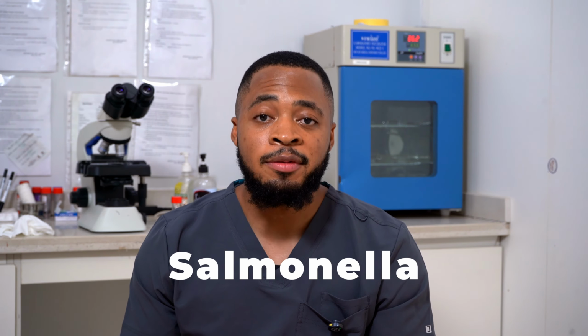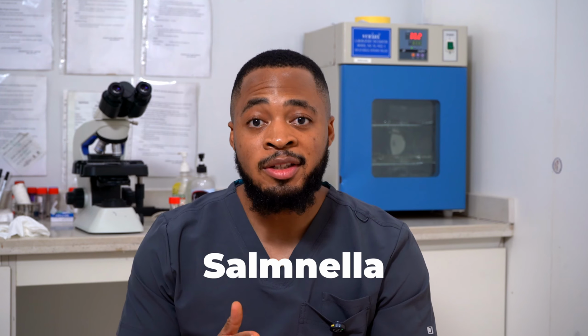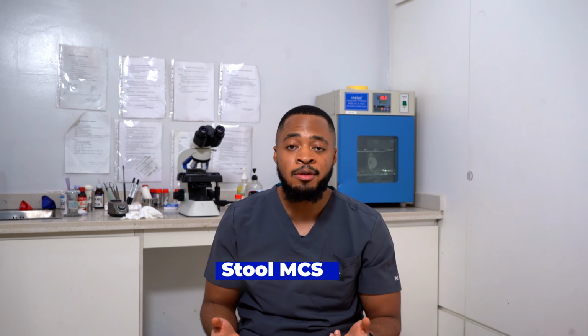Salmonella is what causes typhoid fever and is transmitted through contaminated feces in food and water. But this doesn't mean that if you've had typhoid, someone has pooped in your food or water. What this means is whoever made your food didn't disinfect their hands properly after doing the number 2. As we can already see, the mode of transmission for typhoid is through the feces. So it only makes sense why the WHO recommends stool MCS as one of the most effective ways to diagnose typhoid fever. So the MCS in stool MCS means microscopy, culture, and sensitivity, which will be explained briefly in this video.